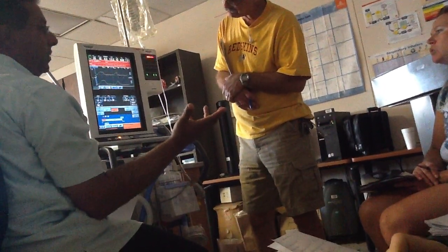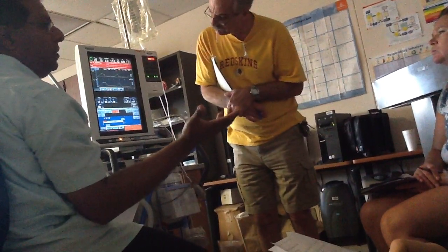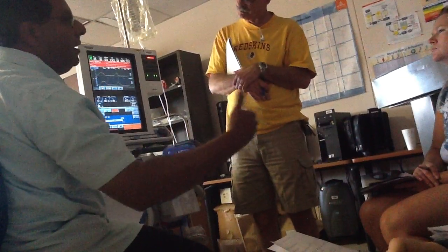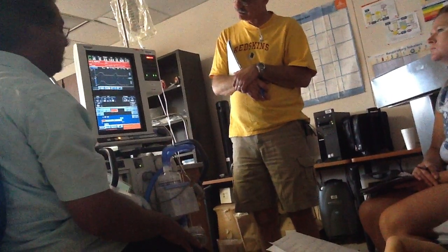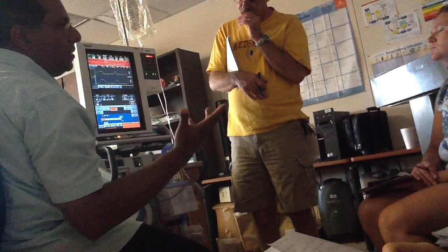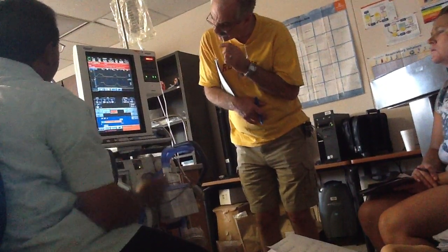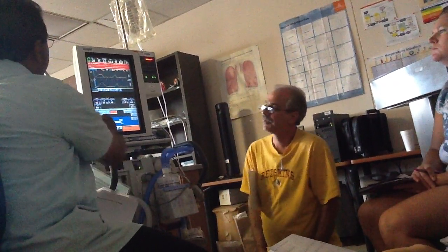Either way, the safest thing to do, if you really want the patient to have IE ratio 1 to 4, then you may want to lock the IE ratio 1 to 4. But if you just want the I locked, you can do that too. If you want the E locked, you can do that too. How do you push the E? See that? The last one is TE, expiratory. The middle one is IE.